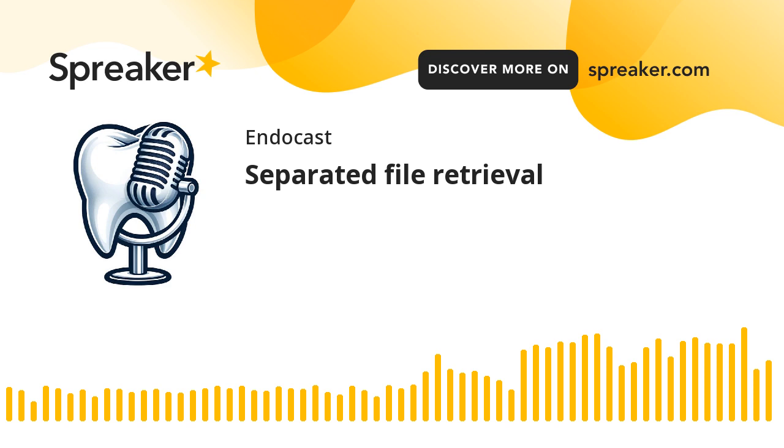Now we want to remove the file. We have one of two options: either to vibrate the file or vibrate beside the file so that the file pops out, or we have to catch the file somehow and pull it. Am I right?